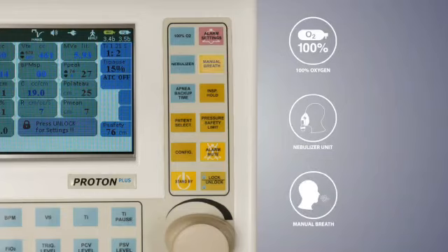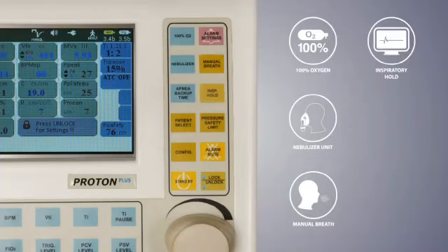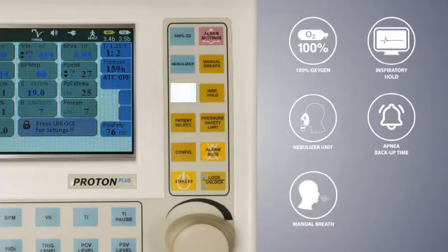Manual breath delivers extra breaths to the patient in duration of the ventilator being administered, at the set tidal volume. Inspiratory hold holds inspiration for measuring plateau pressure.